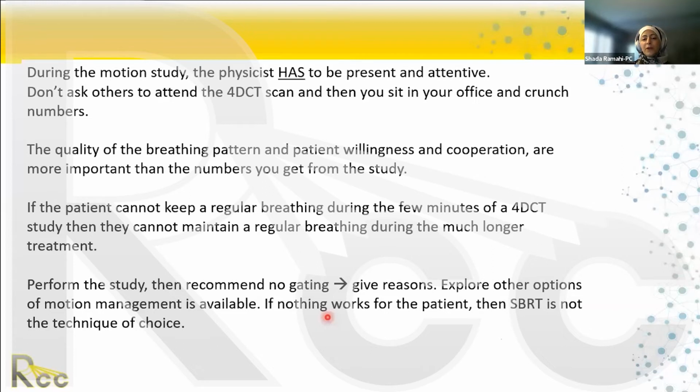So in the institution where I work, physicists have different tasks over the month. And for the physicist who is tasked to do motion management, that's the only thing they do for that month. Because that physicist could be basically in the CT sim all day. We're doing 4 to 5 motion managements a day, which could take an entire CT simulation work schedule. We have 2 CT sims, so don't worry about that. We have another CT sim to carry the regular load of the department.